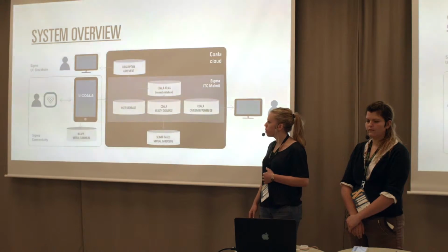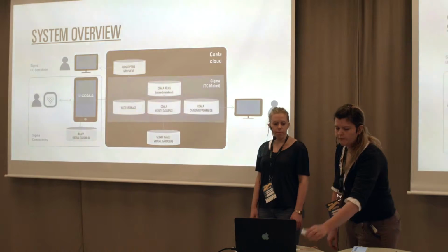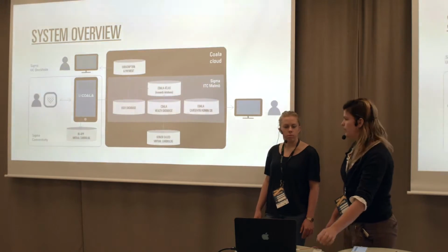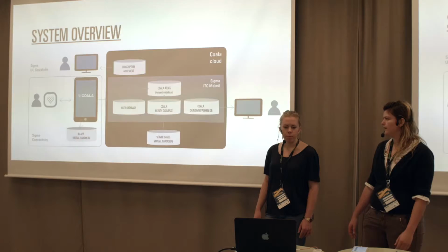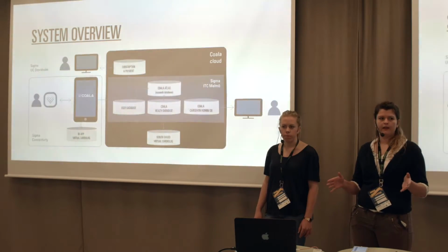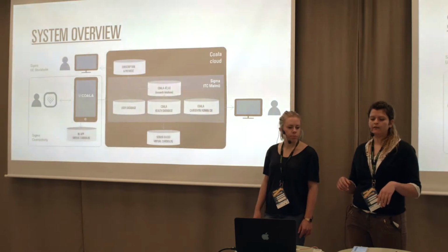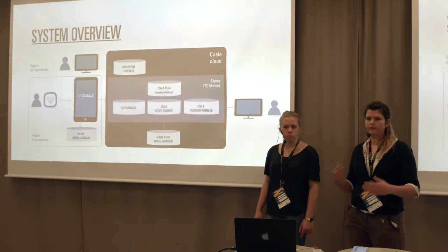We made the app and this little device, both the hardware and the software for the device, and then the two applications. And you also designed the UI for the portal, the web service. Yes, so doctors can log into the portal and request to see the data from a specific patient user, and you can have a conversation with them and talk about the result.